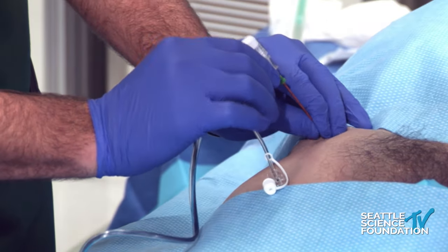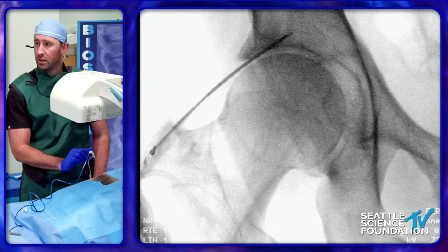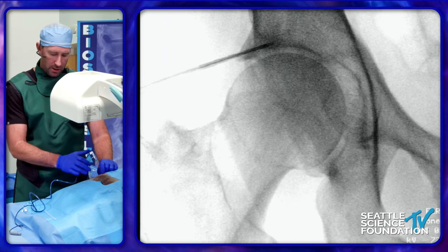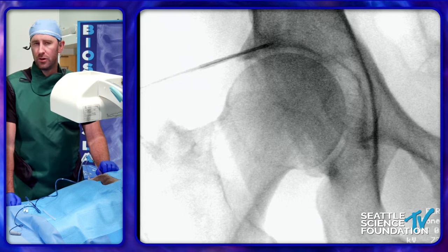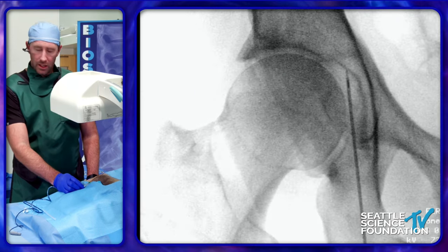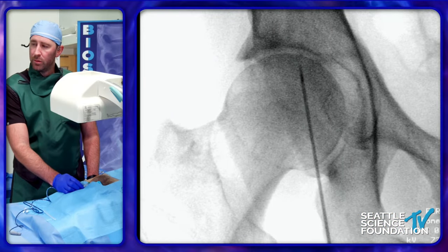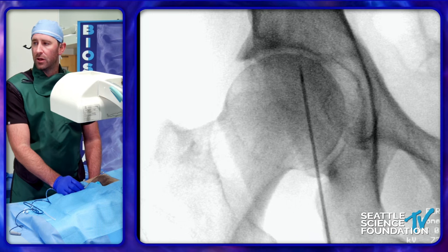We hit both the 11 and 12 o'clock positions to guarantee coverage. When doing this procedure I'm running two needles simultaneously — while placing the obturator I'm usually running them at the same time and redirecting. One of the important safety considerations is avoiding the femoral vascular bundle — the femoral nerve, artery, and vein. That bundle runs along about the medial 20% of the femoral head, and when we're targeting the obturator nerve down at the ischium, we want to pay close attention to avoid it and prevent a hematoma.